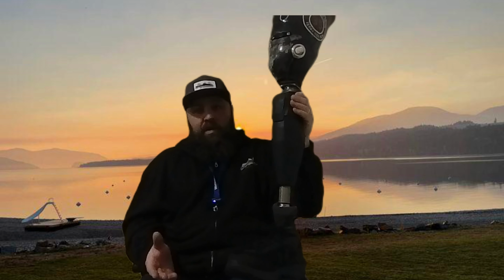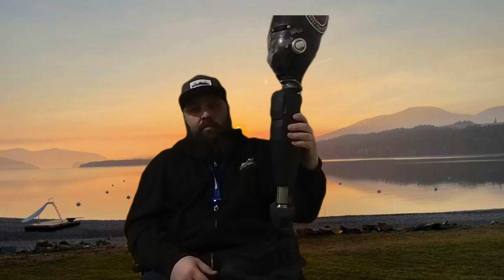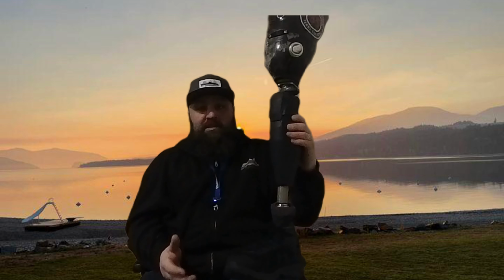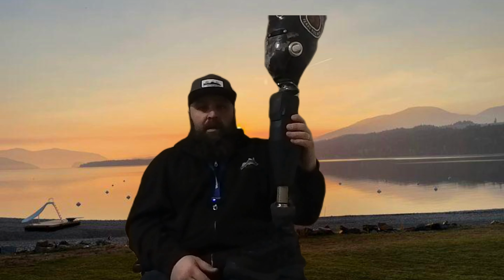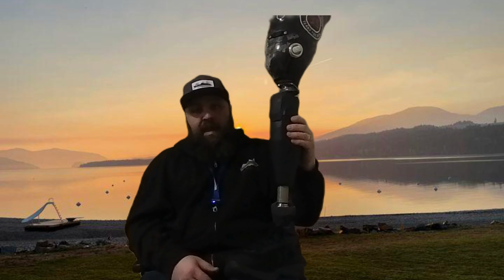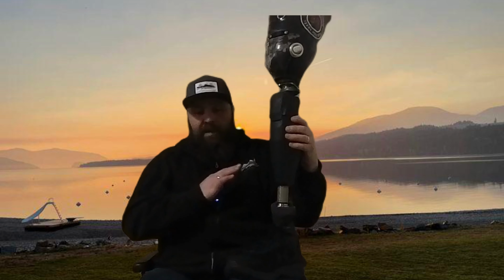Now, the knee in that video I just showed you, this comes in two different levels. So it comes with a Genium, just a regular Genium, or a Genium X3. Now, the Genium X3 is a waterproof knee. It was built for military veterans, so it's military standard of being built. Unfortunately, I can't get the funding for that, so I've got just a regular Genium, which has everything else.